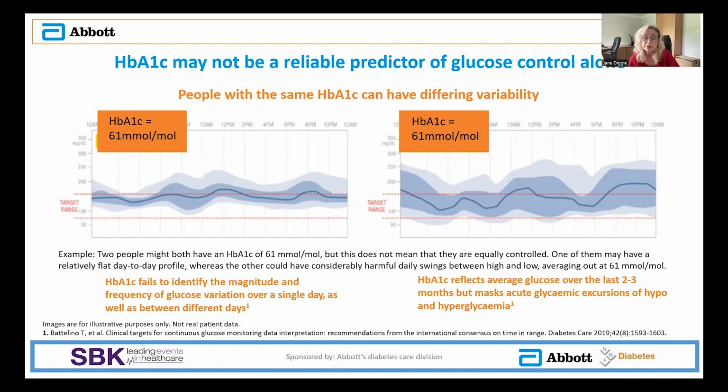So for the blue, you can also see around that median line, you've got a blue shaded area and also a light blue shaded area. And that's actually giving you the variability. So it's giving you the other readings that are appearing at that particular time of day. And again, in the person on the left, it's fairly narrow. So those blue and grey bands are fairly narrow. So there is some variation from day to day and at different times of the day, but it isn't hugely variable.